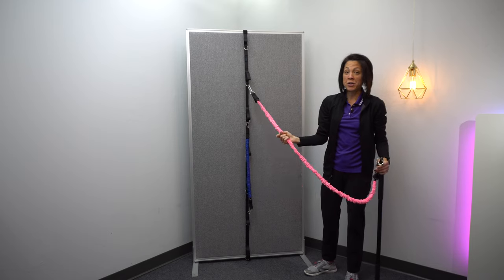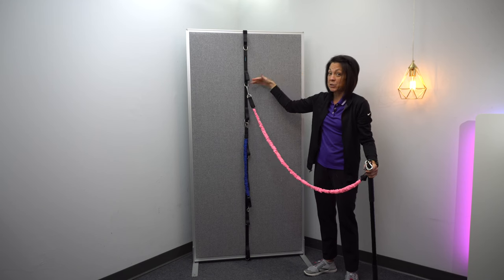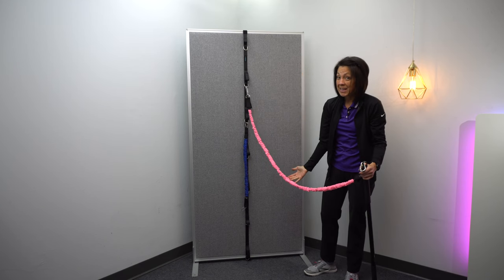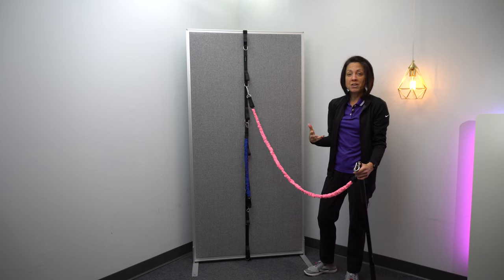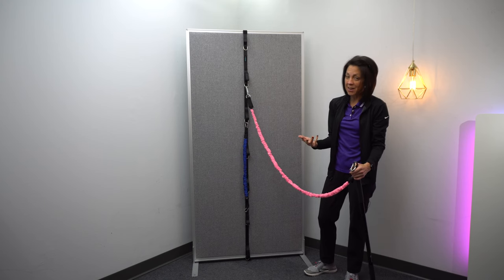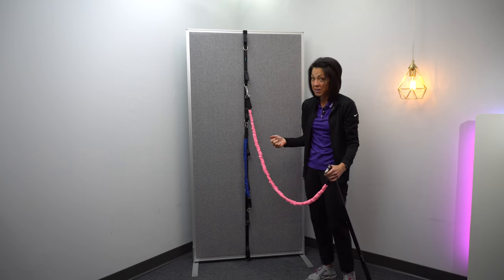And go about your exercises. They're at all these different levels, so you can do shoulder exercises, you can do leg exercises or hip strengthening exercises, as well as some of that resisted gait that I always talk about that is so valuable for those of you that are trying to work on your push off.